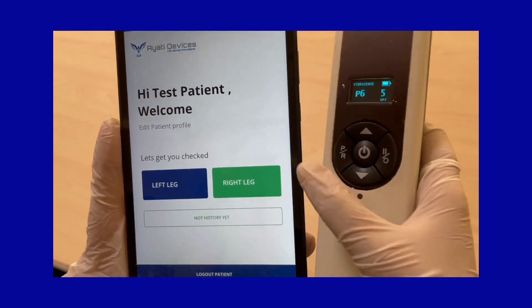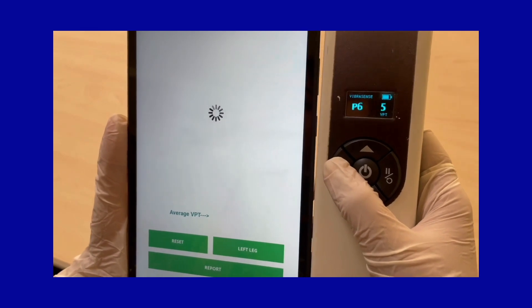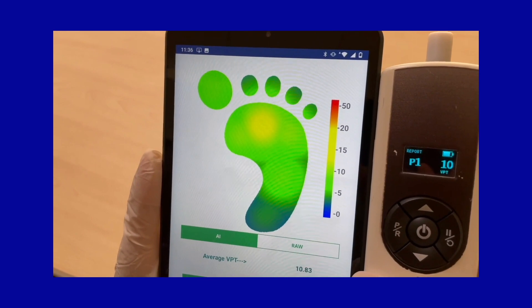Once you have completed the testing at P6, come back to the app screen and tap on the button for the corresponding foot. Then long press the PR button on the device — this will send the data to the app and the report for the foot will be generated in the app.